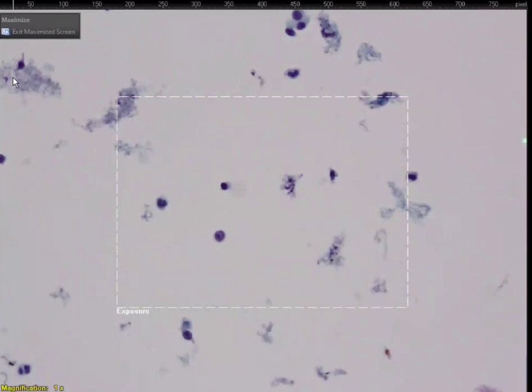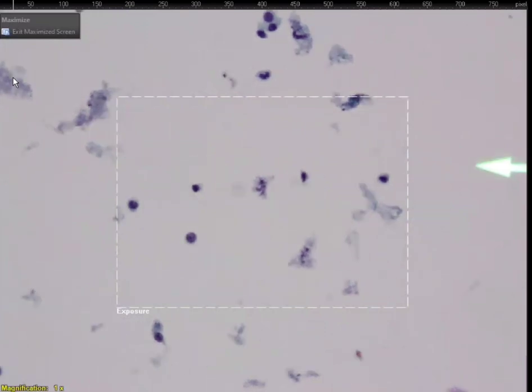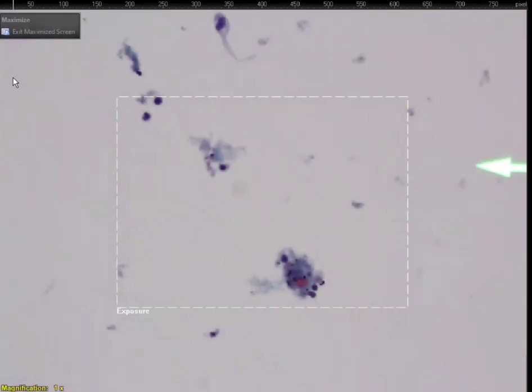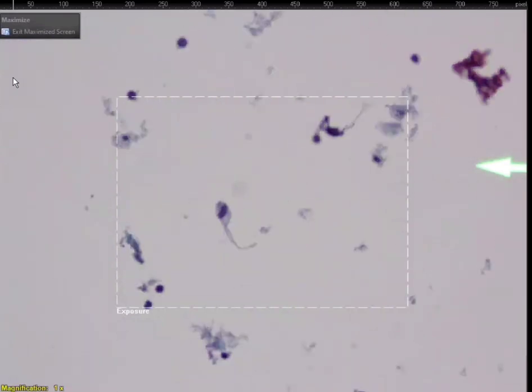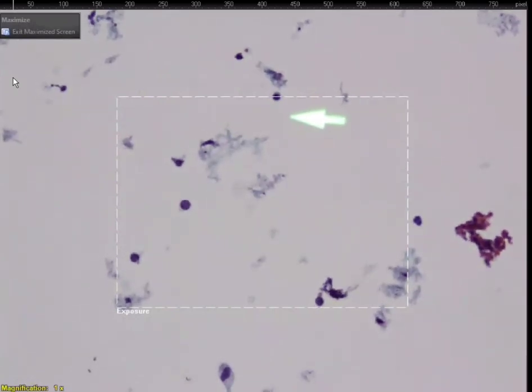Some of these, I'm again thinking respiratory, probably respiratory, because they're kind of stuck together there. How about these guys? This one is lymphocyte. Lymphocyte, but look at how few they are. See that? So this is where you have to start saying, did they get a good lymphoid sample? Why are we getting so much contamination? Okay, so there are a few lymphocytes. Yeah. Are they mixed or monotonous?